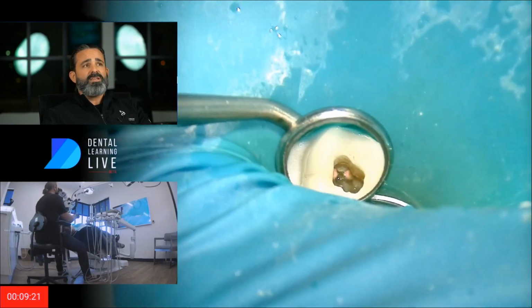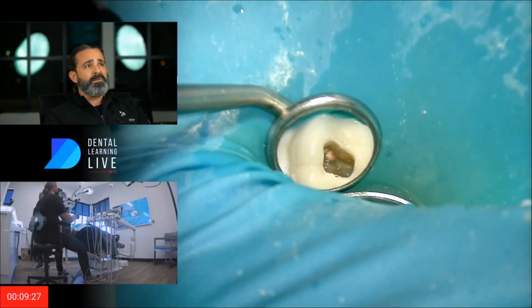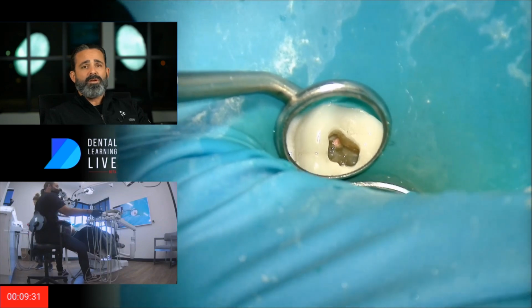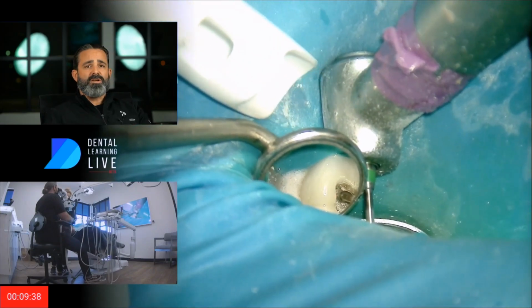And so when I don't see that, I see things that are very homogeneous in there. I'm always comforted that I'm in a good, clean environment. That, and sometimes the smell, right? And so this environment seems pretty predictable, pretty good. I'm not worried about the crown leaking. And now I'm actually just cleaning up the floor, and we'll get started on the retreatment protocol.